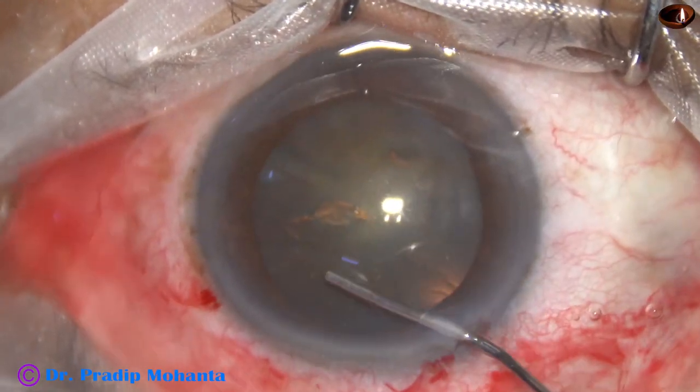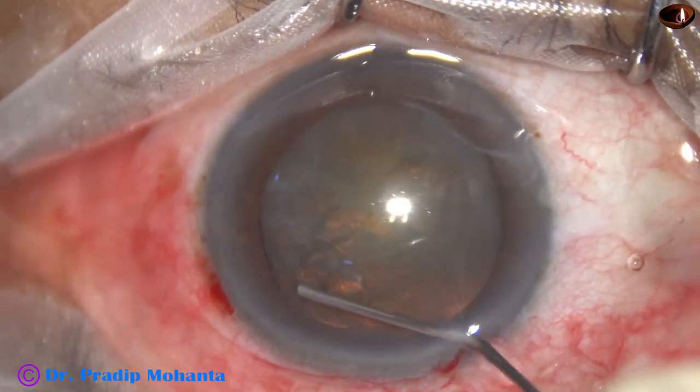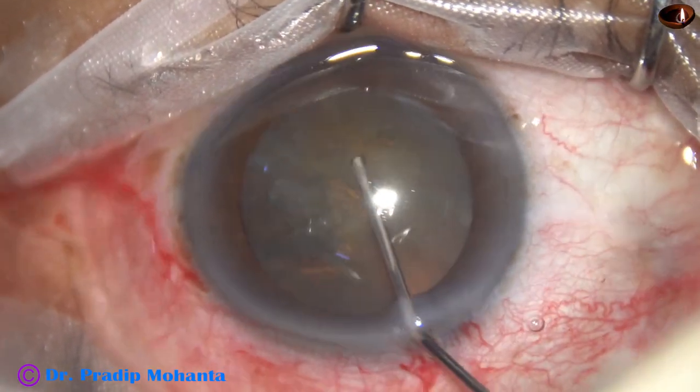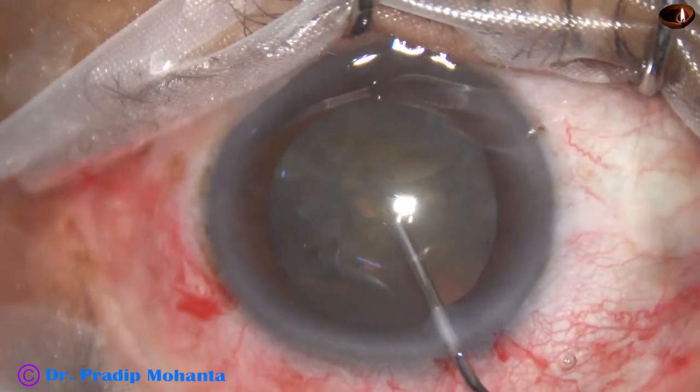Hydrodissection is done with BSS and a 27-gauge cannula. The nucleus is mobilized.